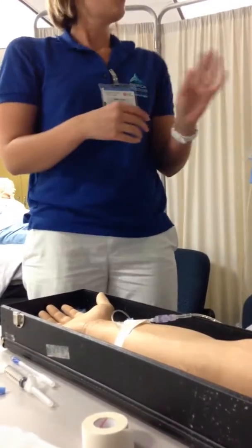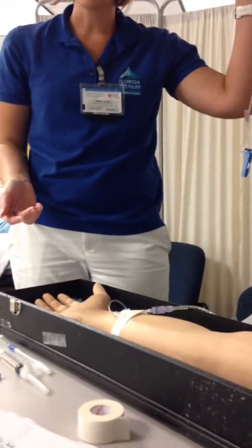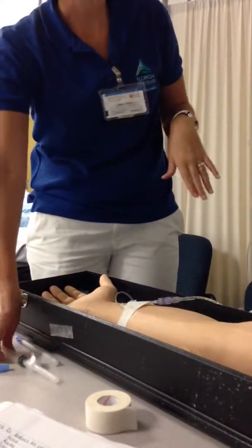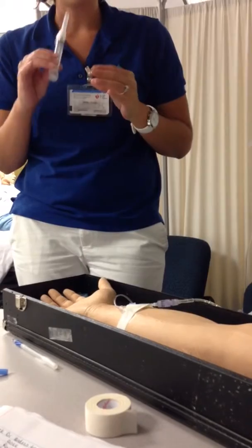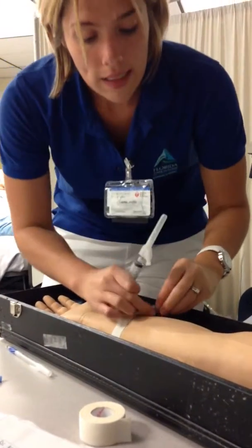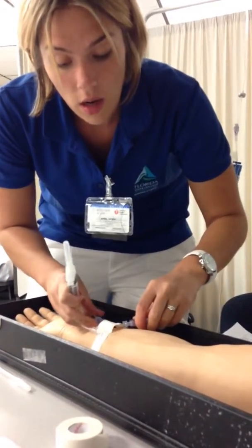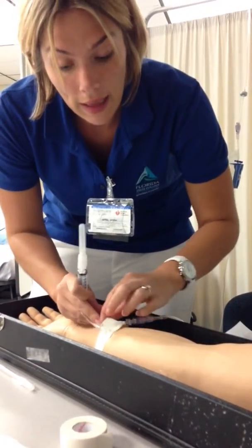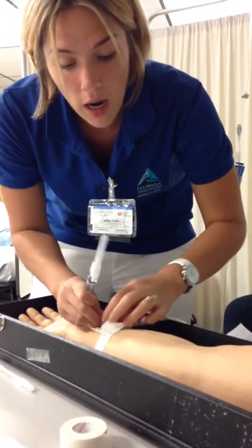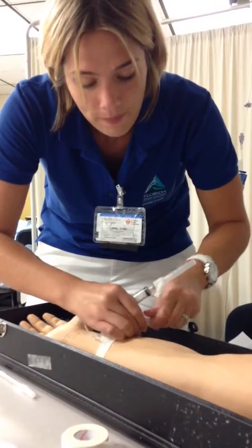At this point, an hour has passed. Now I come back in. My mini bag is empty. The medication has come in. I still have 3 mLs left of my normal saline. I am going to disconnect from the port. I'm going to clamp it at this moment right now. I'm going to disconnect.